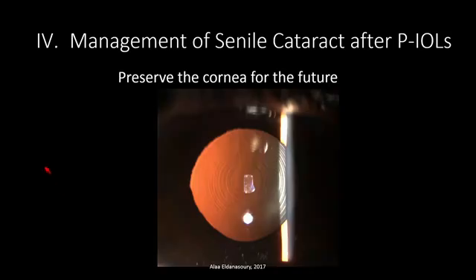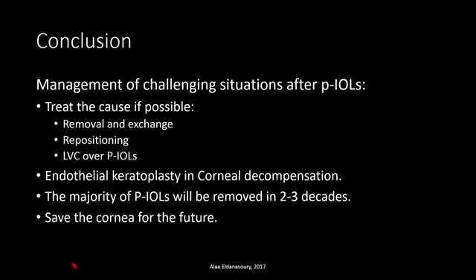The last category, which will be more and more common with time, because these people, remember, we are treating mostly myopic patients, maybe high myopic patients, and these people will develop senile cataract later on. And the main advantage of phakic lenses, in my opinion, is that you're preserving the cornea for the future. Today, we are having excellent outcome with multifocal lenses. You can imagine the advances 20 years down the road. These patients who have a phakic IOL today will benefit from these advances 20 years from now when they develop their senile cataract.